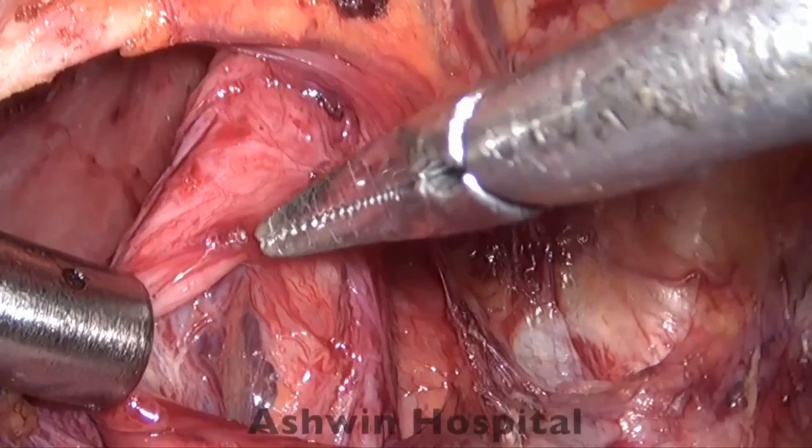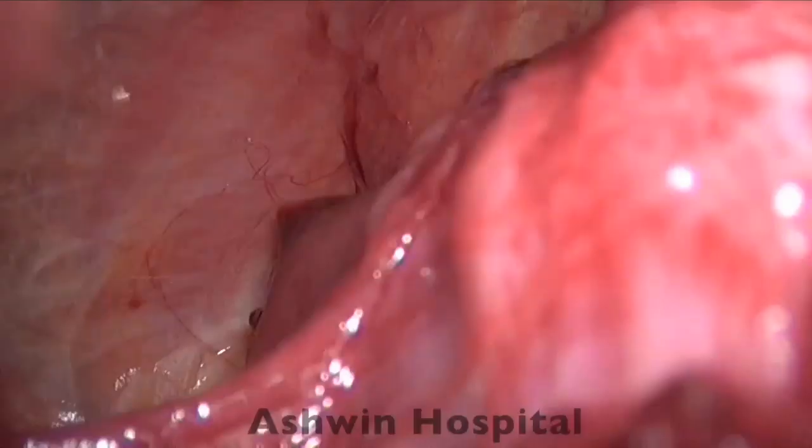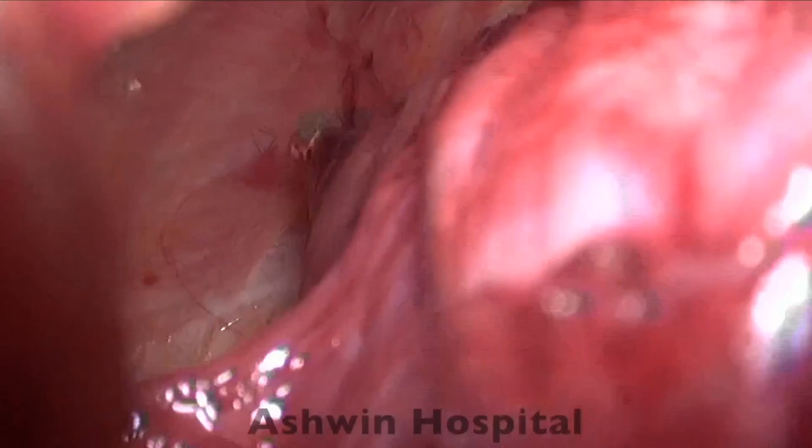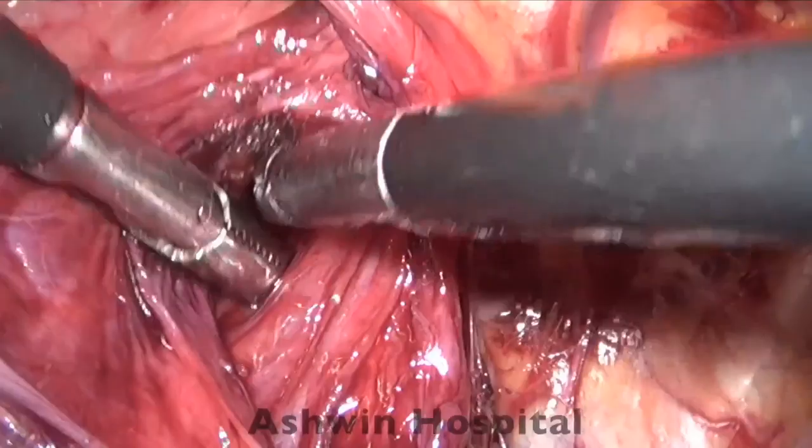Once again, the key is to make sure that we stick very close to the peritoneal sac. And here we have tried to encircle the sac. This is how generally we perform the indirect hernia dissection, so that it gives us a good sense of safety and we do not have to be worried about the vas at all.